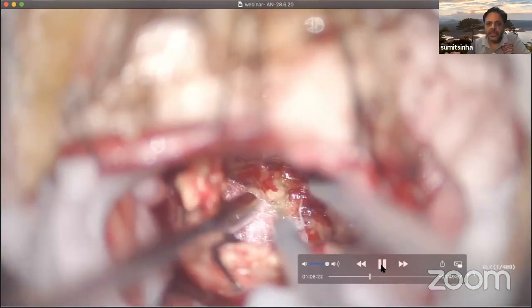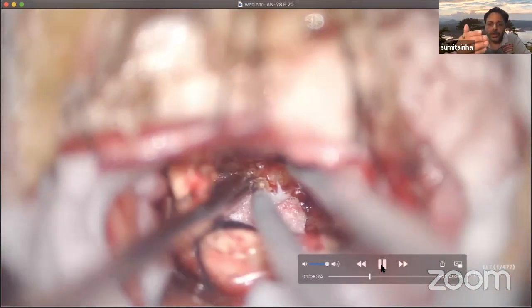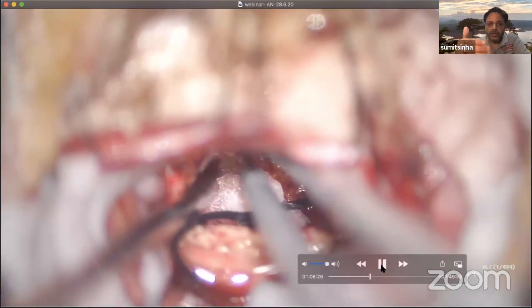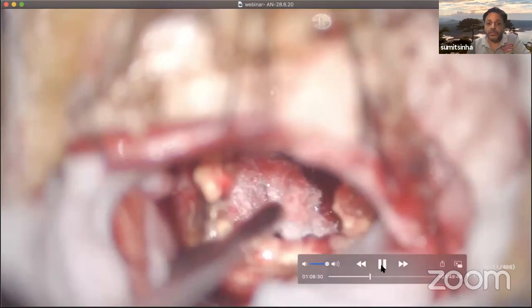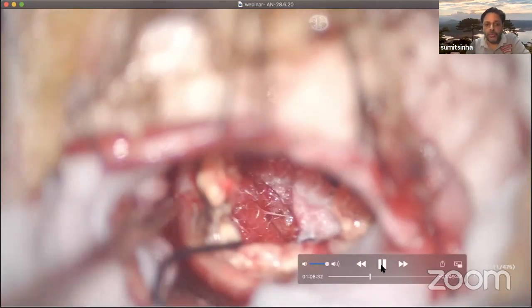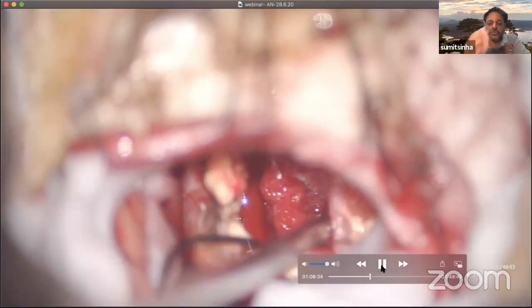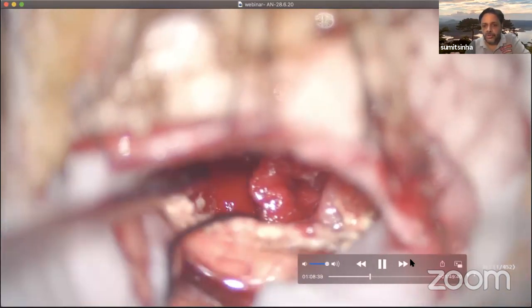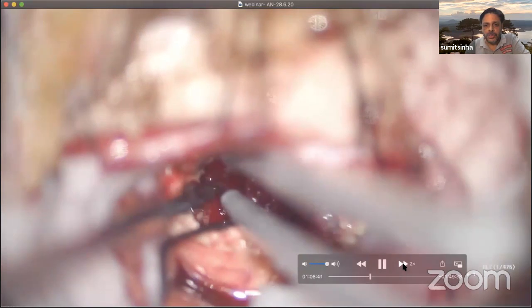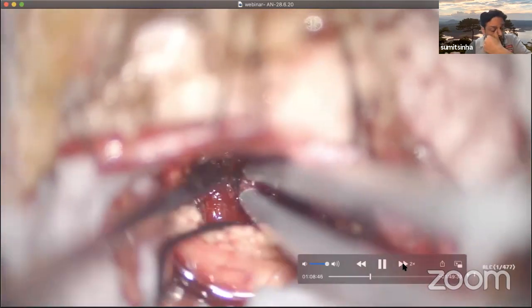Then you have to stop there and then, lest you otherwise encounter a tear of the tumor capsule and go on to the other side. This is the last thing that you want to do during your surgery, to injure the tumor capsule. So this is the feel that you can get while you are doing the CUSA, doing the internal decompression.